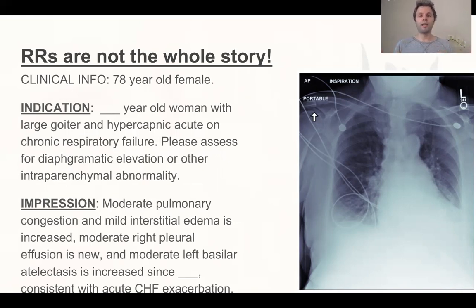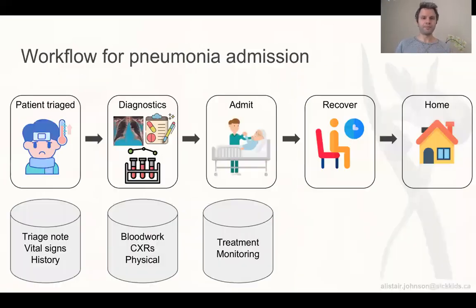And the radiologist says, okay, yes, I see that. There's definitely this pathology going on. I see this other one. Here's what I think this could be, right? So the radiology report is not a ground truth label. It's a conversation. And it's very important to factor in this indication when you are understanding an image with its impression. So a lot of methods will just label the image with the impression. But if I didn't ask you about, say, fractures in the image, then you're not going to mention it in the radiology report, even if there is one, or at least you're not necessarily going to.